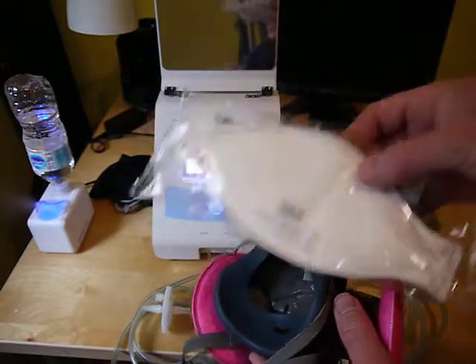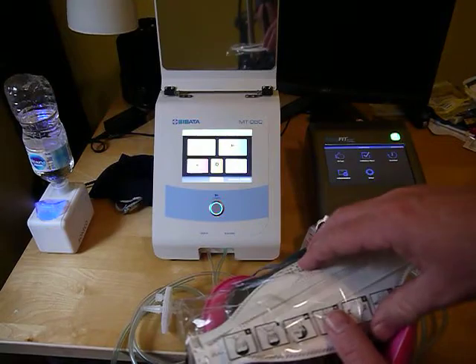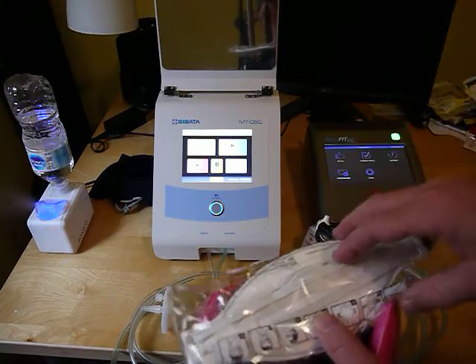Also, you see how this is stored in a little bag? I've had cases where these are left open and we've had failures just because they've been sitting around.